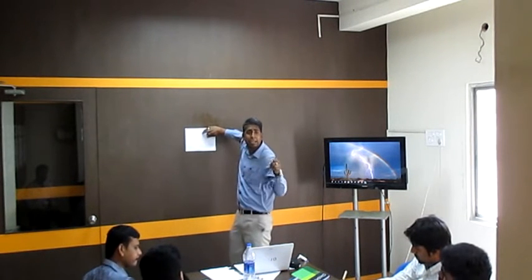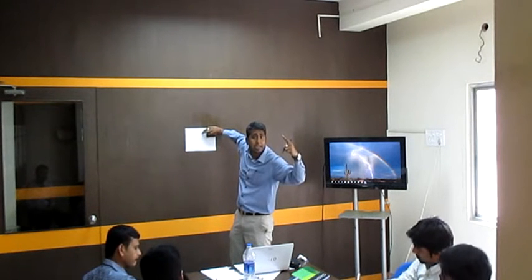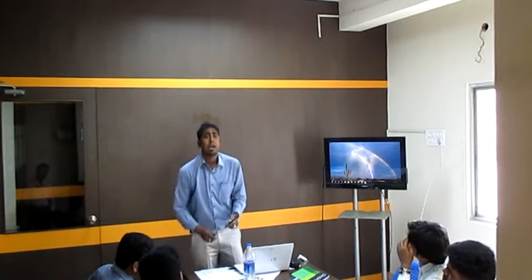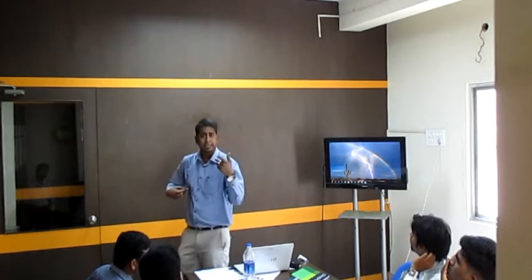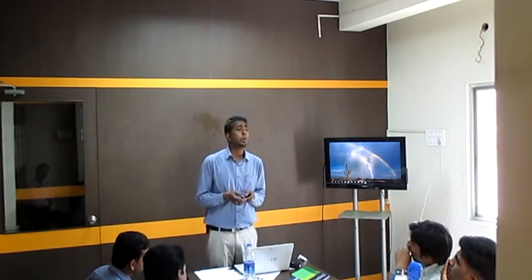It means 20 rotations of your micromotor will cause one rotation of your burr. These kinds of handpieces are most of the time used in endomotor applications. I can tell you, in case of endomotors, physio dispensers, and bone surgery units.